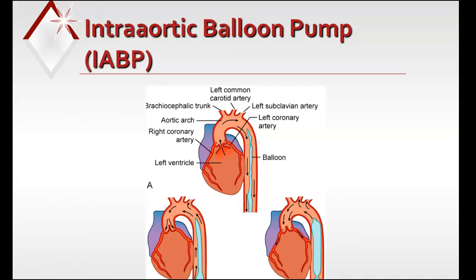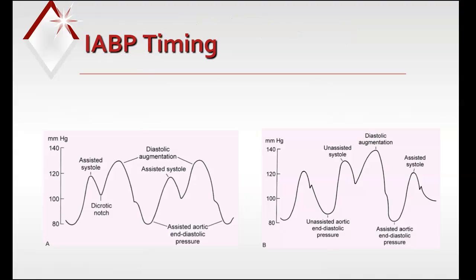You can kind of see that sausage balloon here. You can see it in the deflated position, and then you can see it going into the inflated position. And again, your ECG is what triggers this thing to inflate and deflate. It's going to watch for that R wave for deflation, and it's going to inflate on that T wave when we've got ventricular relaxation. Okay, and that's what you're going to use when you see this actually working on your ICU patients.